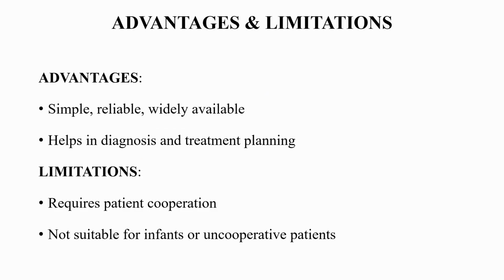So in the end, the last slide is the advantages and limitations. So it's a very simple, reliable and widely available test, and helps in diagnosis and treatment planning and prescription of hearing aid. While there are certain limitations, as this test requires patient cooperation and is patient dependent.